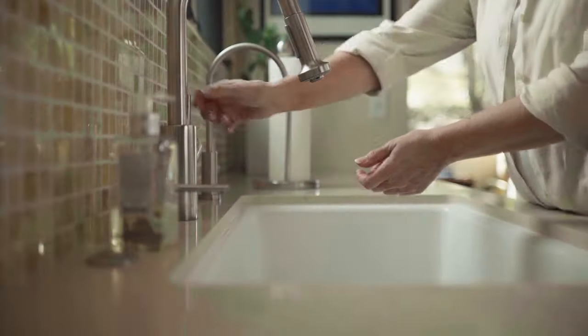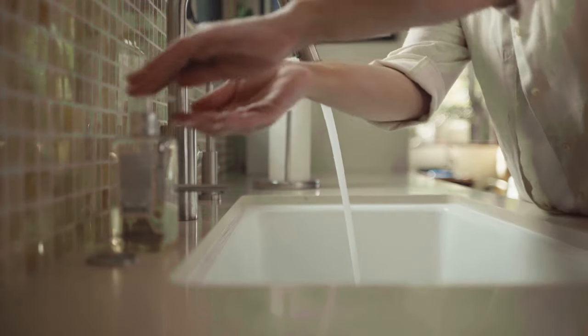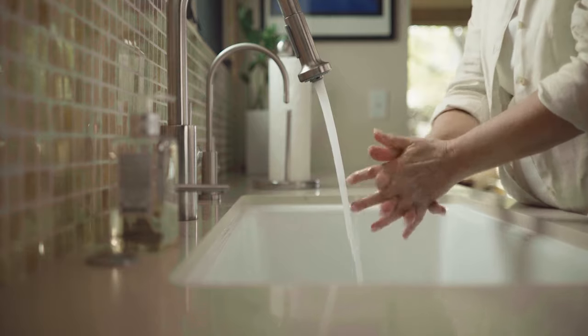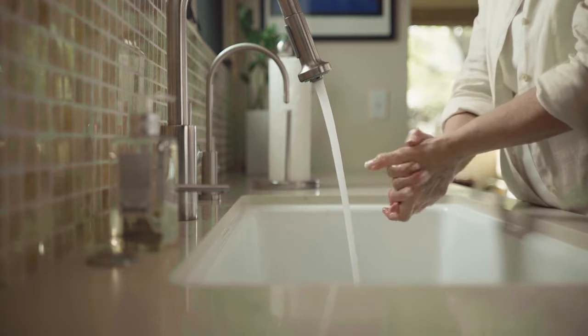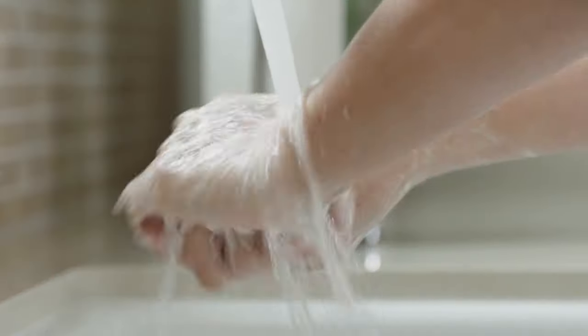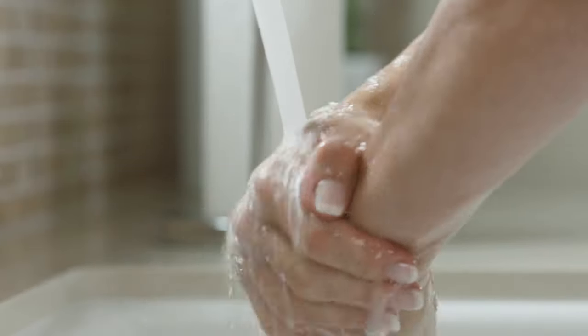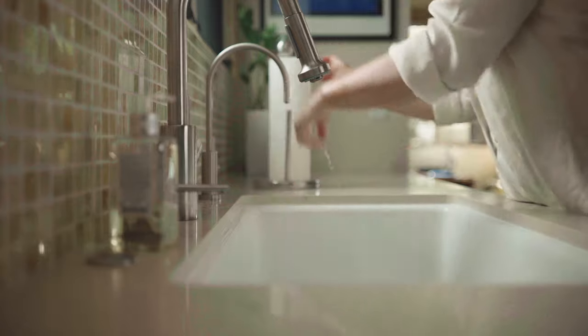The drainage procedure should be done using a clean technique. Before beginning each drainage procedure, remove any rings and wash your hands thoroughly with soap and water for a full minute, even though you'll wear gloves during the drainage procedure. Dry your hands using clean paper towels.